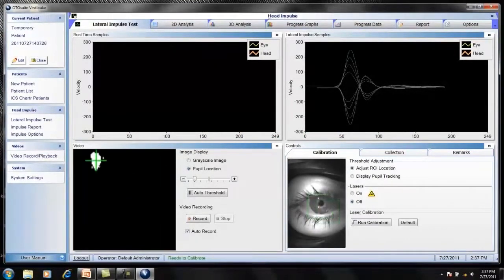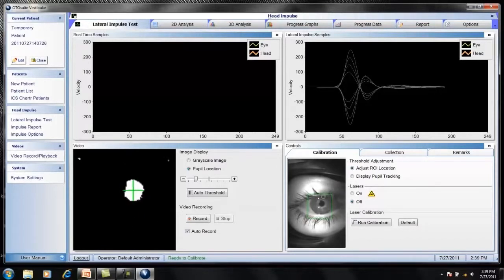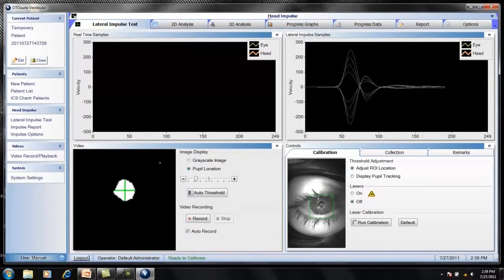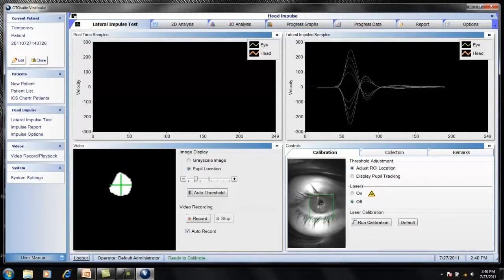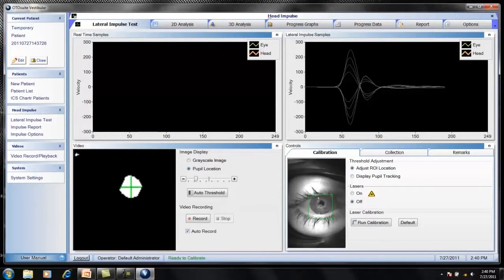Let's go into the ICS Impulse OtoSuite V software. The first thing to note is you want the pupil within the box. If you have a patient who has quite a bit of mascara on, it is best to remove the mascara. But if you don't have mascara remover, you can lower the region of interest box so that it's right below where the eyelashes are. The algorithm looks for a circular dark area which is the pupil, and the lashes will not interfere very much — but if the patient has a lot of really dark makeup and you can't get them to take it off, lower your ROI a little bit below where that makeup is.